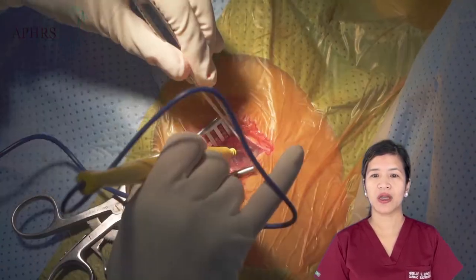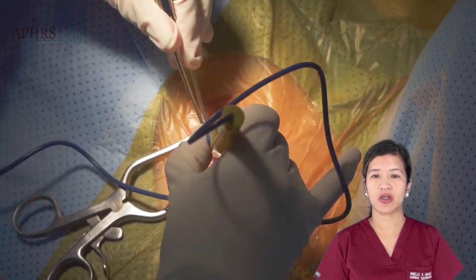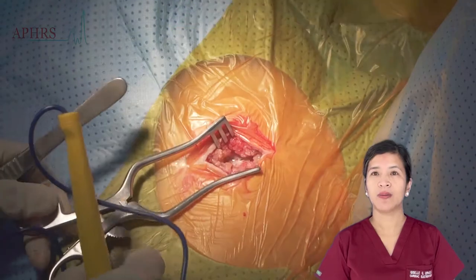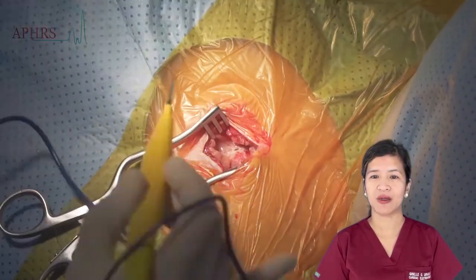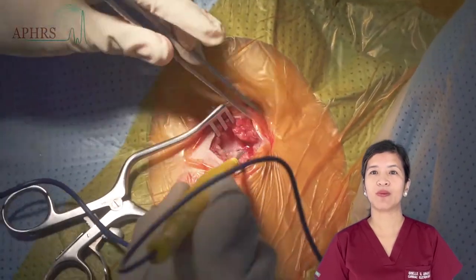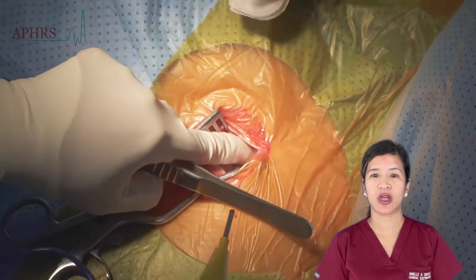Here we are doing a plane-by-plane, layer-by-layer dissection using electrocautery. One crucial tip is that we need to be constantly palpating for the presence of leads that may be inadvertently positioned superficial to the generator.